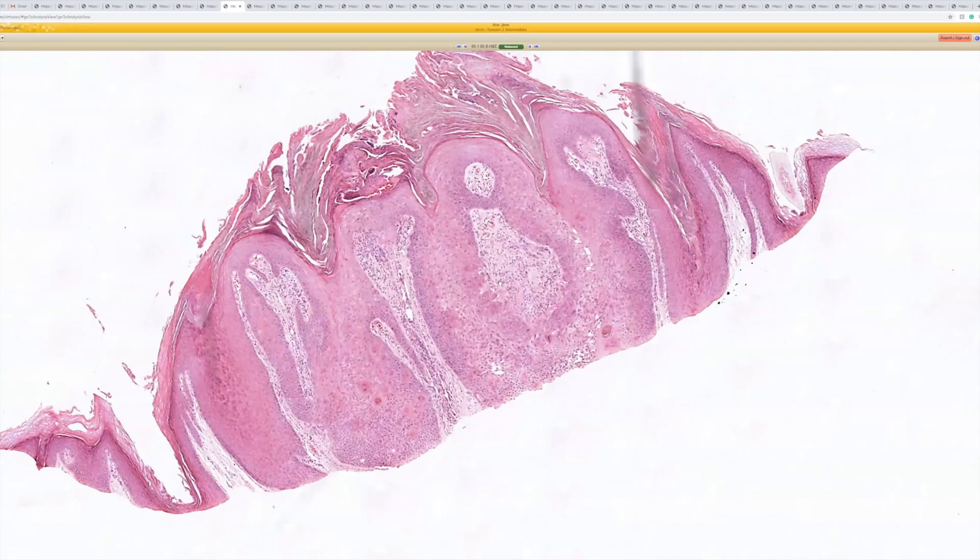Sometimes they're ulcerated on the top and have a lot of stromal edema and inflammation in the dermis. They're often transected because they push down. So when they get shaved off by the dermatologist thinking they're going to maybe be a squamous cell or something like that, you often don't see the base.